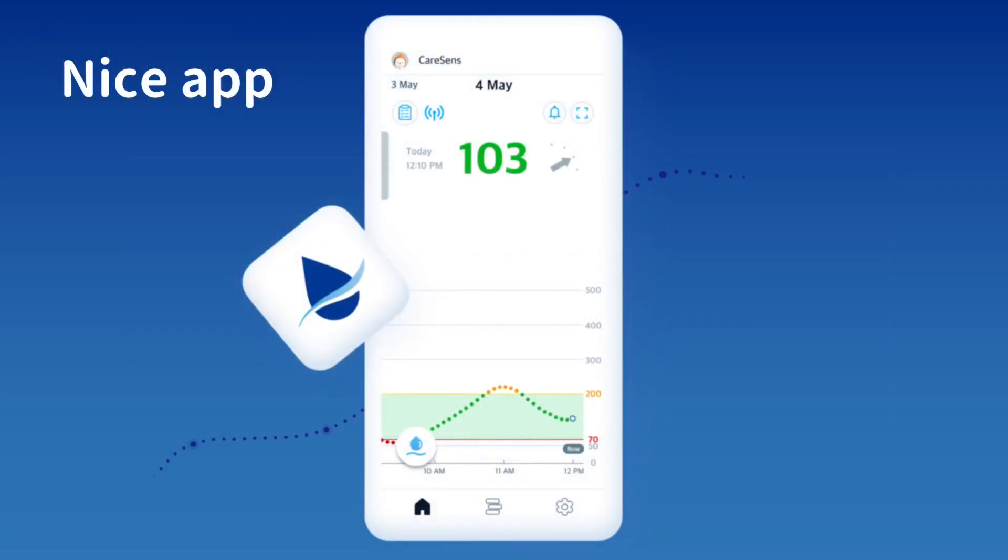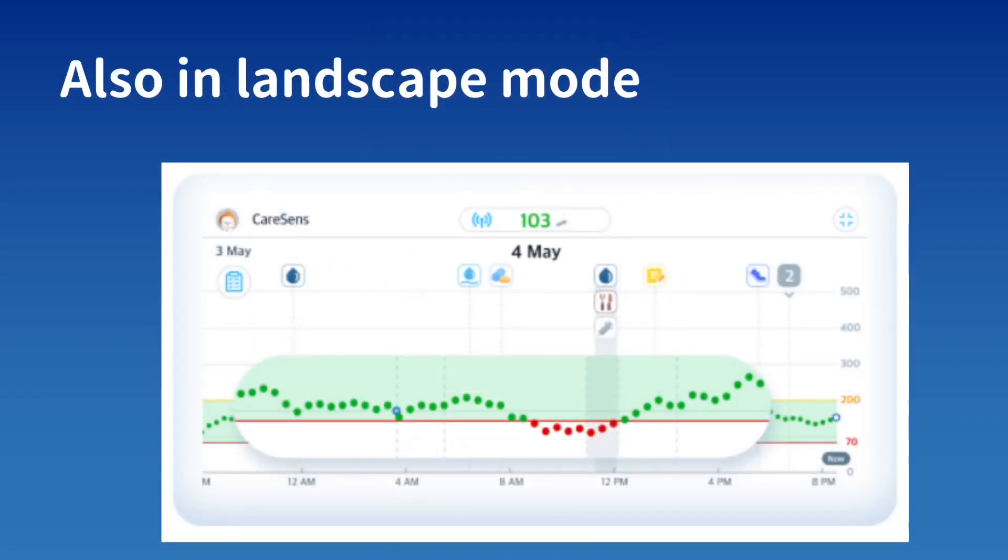It also has a nice phone app. You see here a three-hour window graph, which I think is quite nice for seeing what has been going on recently. It's colorful, and it also runs in landscape mode. If you enter logbook events, you get these nice icons linked with that — so that's quite good.